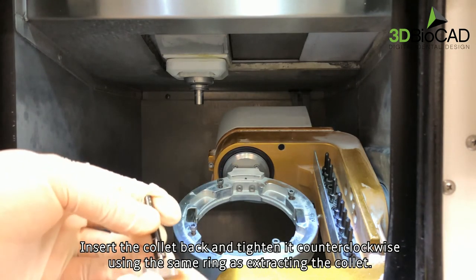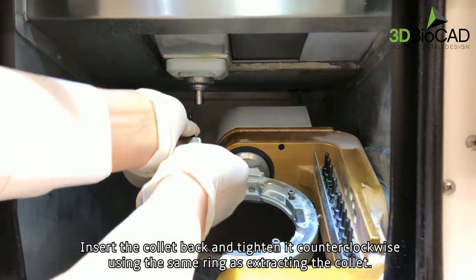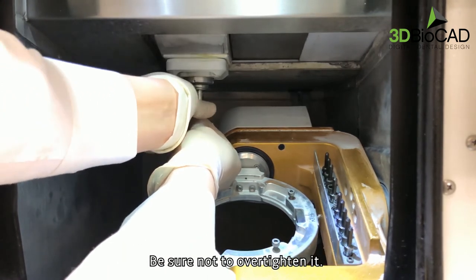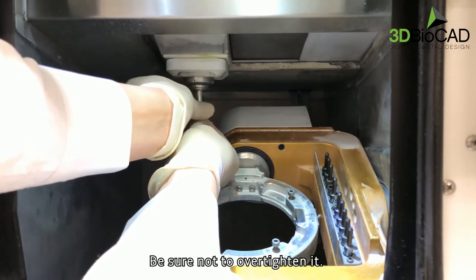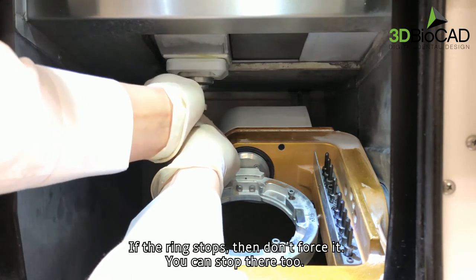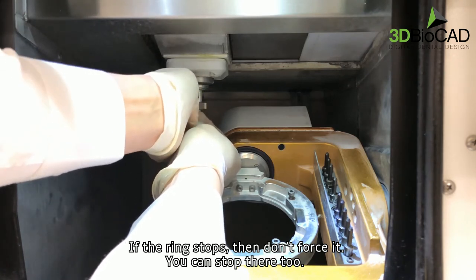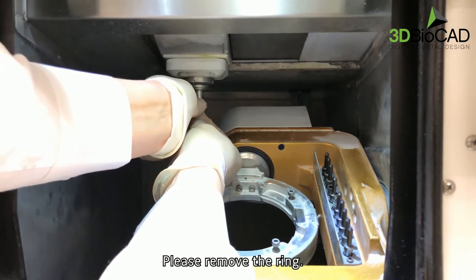Please insert the collet back and tighten it counter-clockwise using the same ring as when extracting the collet. Be sure not to over-tighten it. If the ring stops, don't force it — you can stop there. Please remove the ring.